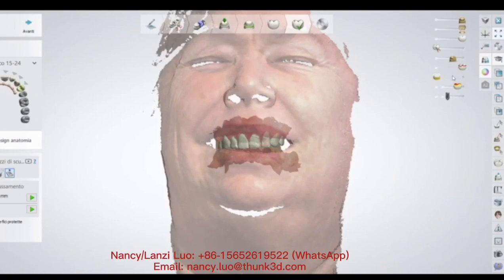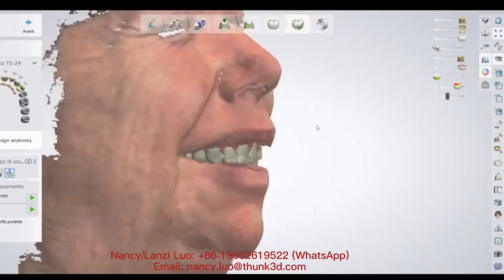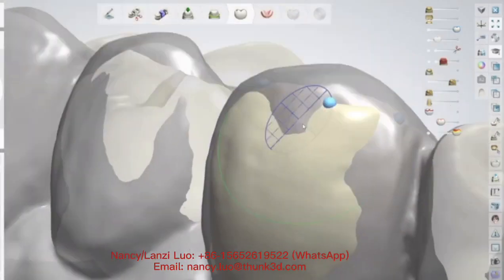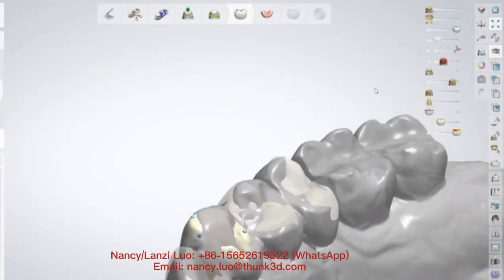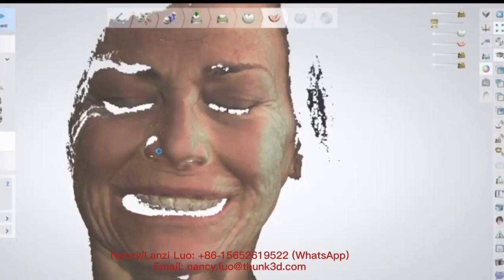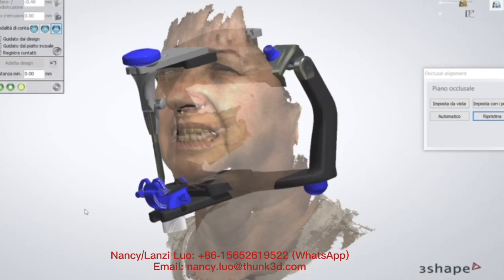This is my second case — this is a provisional that I designed thanks also to my facial scanner. This is my third case; here I'm modeling, so I speed up the video. And this is the final result — this is my design.